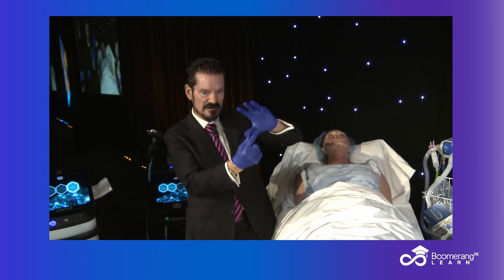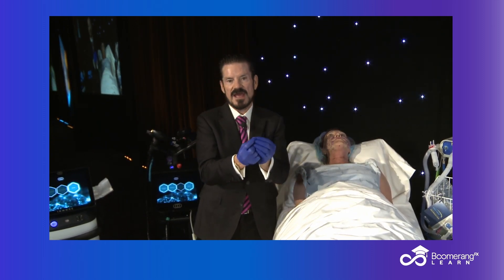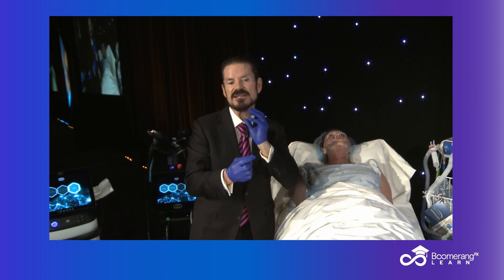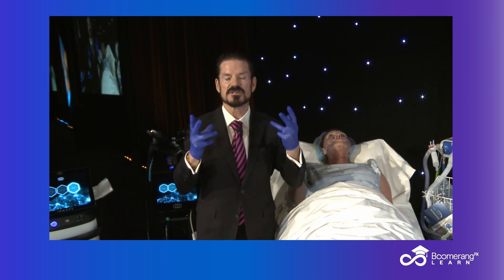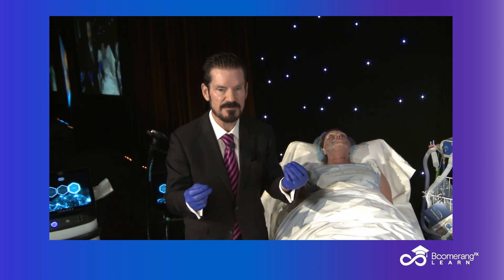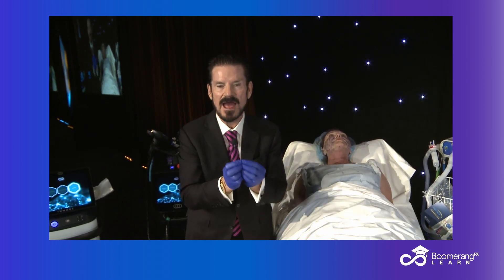We did our pinch test, followed the chart for pulse count, and we ended up having to deploy about 83 to 100 pulses in each zone — submandibular and neck. The total energy deposition time was less than 60 seconds per zone, all in about a minute and a half of treatment.